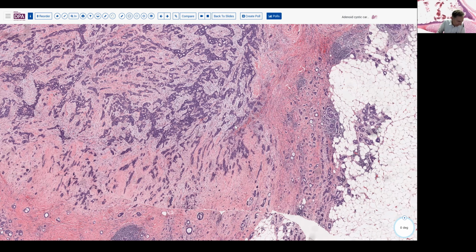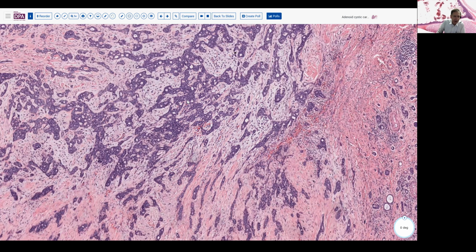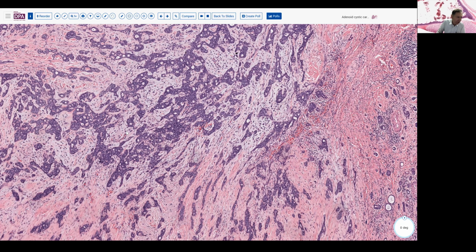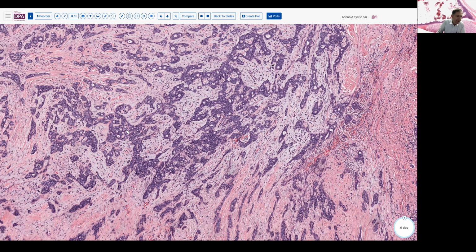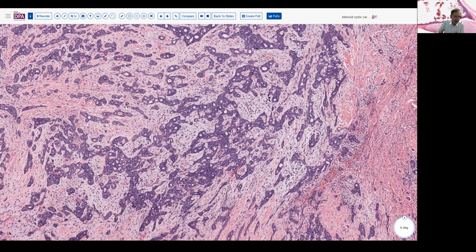In the case of adenoid cystic carcinoma, these tumors in the vulva will stain with the same markers that we would see elsewhere. That is, they would have some epithelial and some myoepithelial markers. And quite helpfully, they are also usually positive with CD117, which I think in an unusual location like this, a carcinoma positive for that marker would be highly likely to be an adenoid cystic carcinoma.